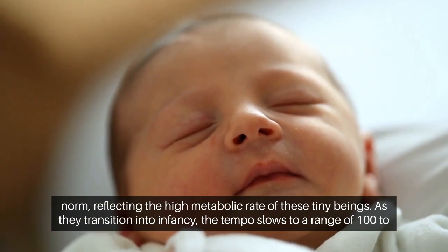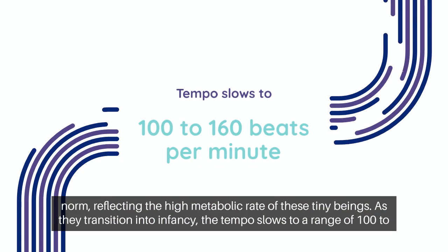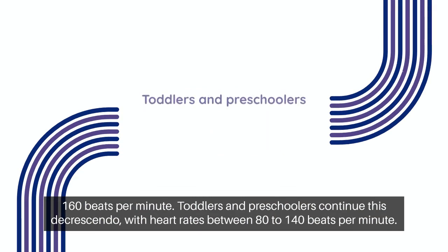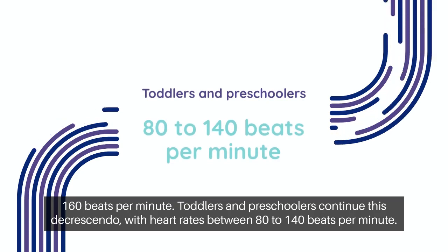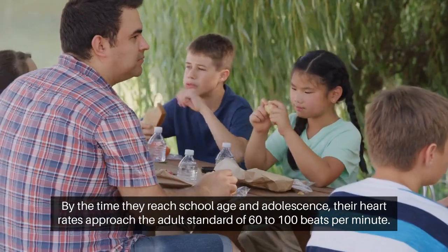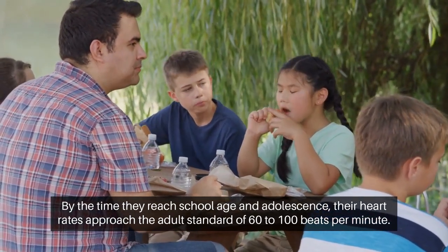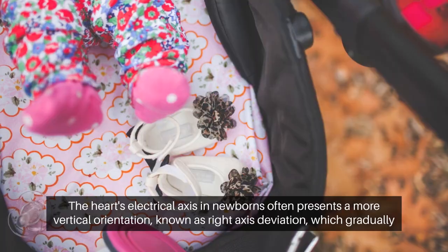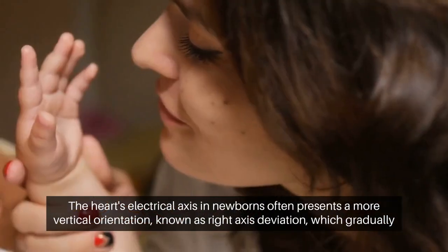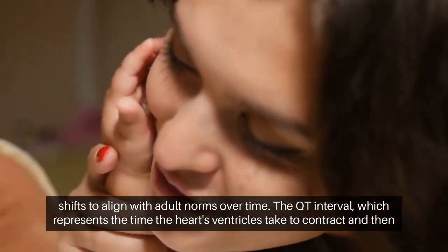reflecting the high metabolic rate of these tiny beings. As they transition into infancy, the tempo slows to a range of 100 to 160 beats per minute. Toddlers and preschoolers continue this decrescendo, with heart rates between 80 to 140 beats per minute. By the time they reach school age and adolescence, their heart rates approach the adult standard of 60 to 100 beats per minute. The heart's electrical axis in newborns often presents a more vertical orientation, known as right axis deviation, which gradually shifts to align with adult norms over time.